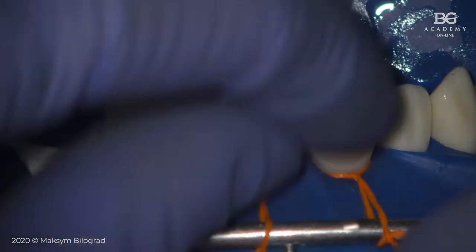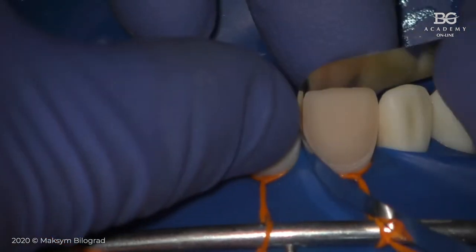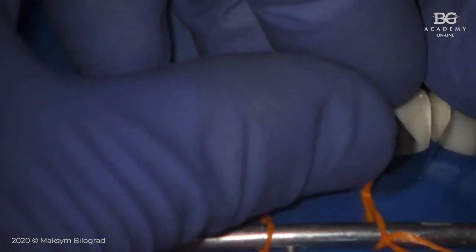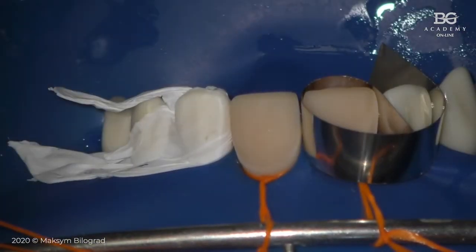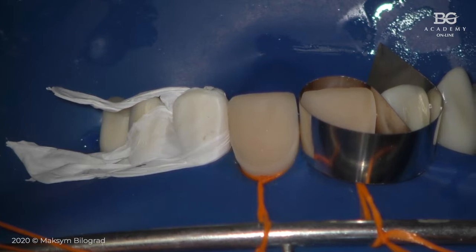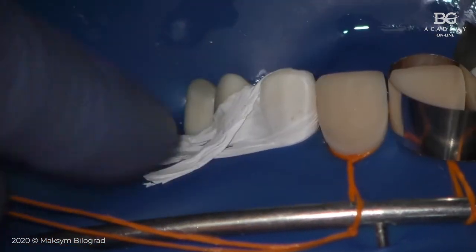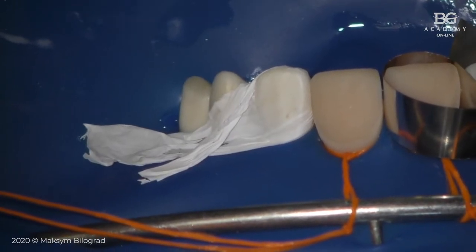I will take a metal band to protect adjacent tooth, like this. Basically, I use metal bands in most of the cases. Like this can be done, okay? Like this. And it is faster, you see. If you use Teflon, just a tip to stabilize your Teflon, because when you will rinse, you will dry, Teflon can fly away.